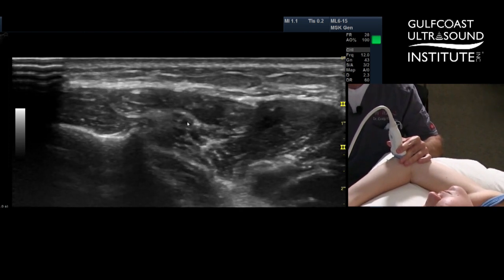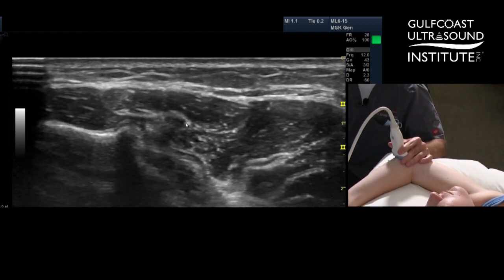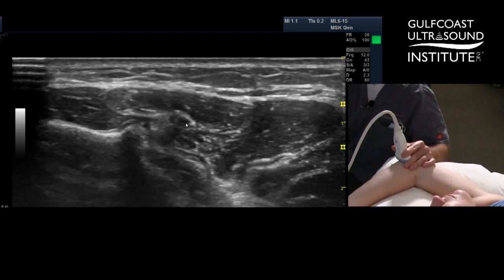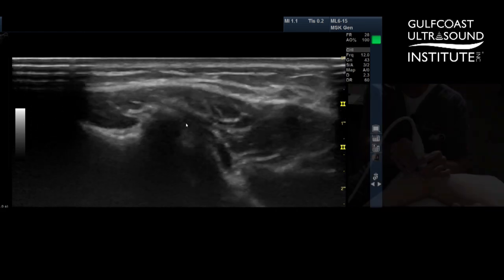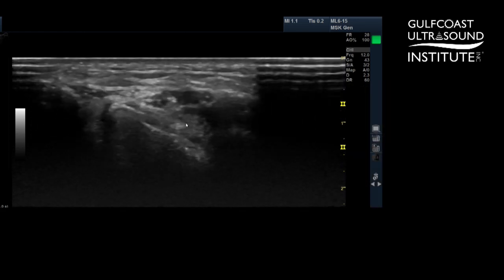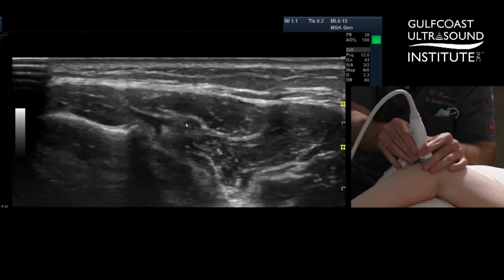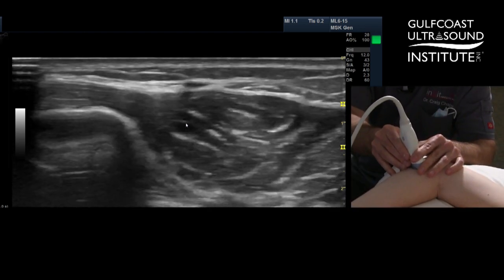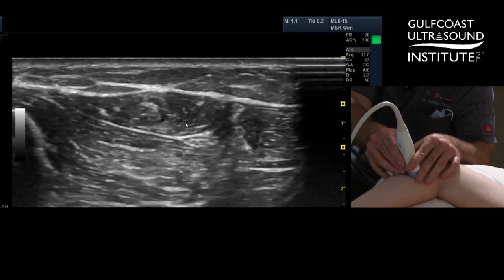And so with nerve injuries, like carpal tunnel syndrome, the nerve will swell proximal to the constriction or the restriction. So I'm not certain that the problem is up here. So even though I see kind of enlarged fascicles, I'm not certain the problem's there, but if I slide down, I see that hypoechoic fascicle, and I keep sliding down the nerve. It's just below the arrow, and they look normal at that level.